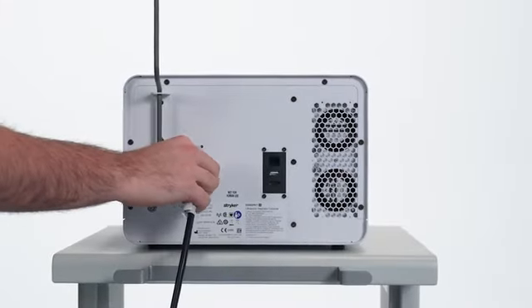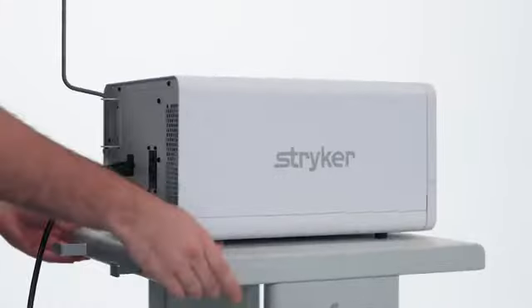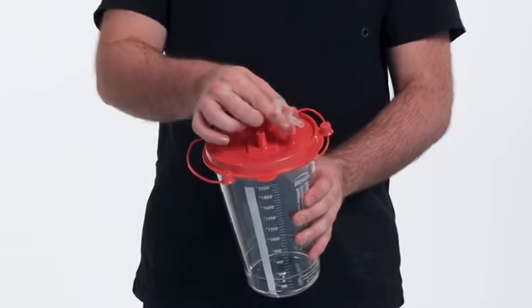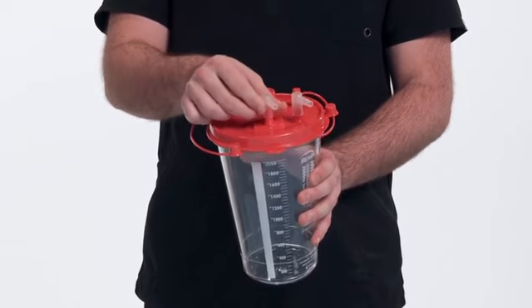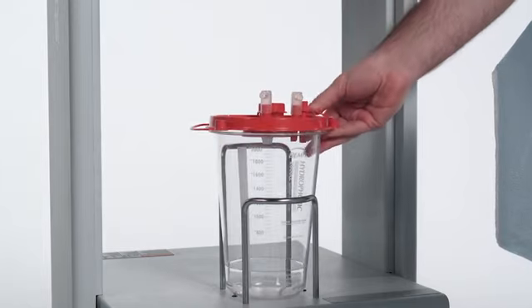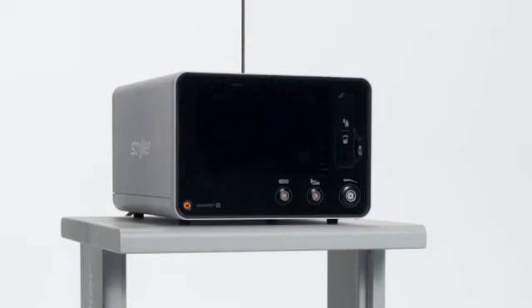Using the supplied power cord, connect the console to a hospital-grade power receptacle. Install the right angle connectors onto the ports of the suction canister lid. Place the suction canister into the holder on the Sonopet cart. Press the power button to turn the console on.